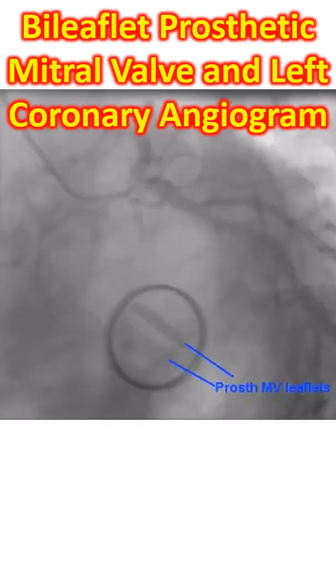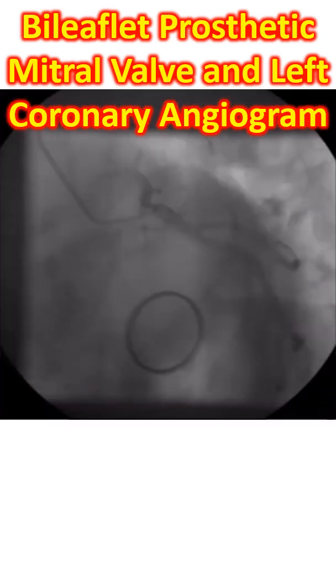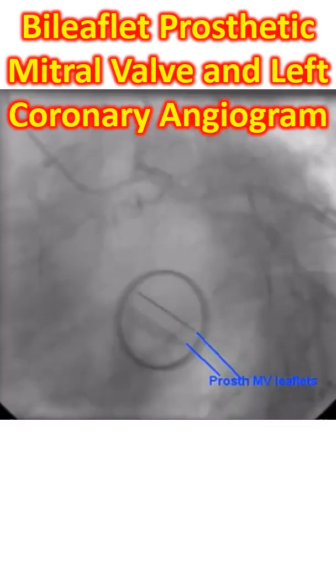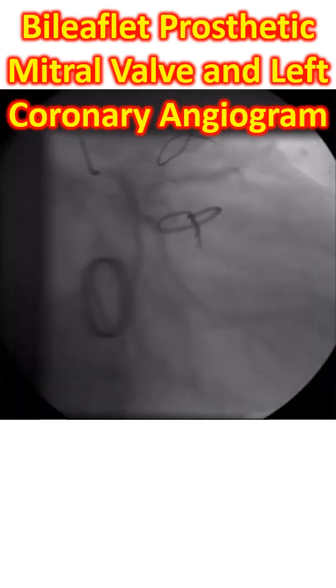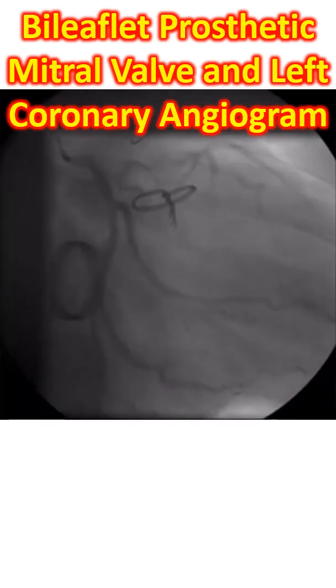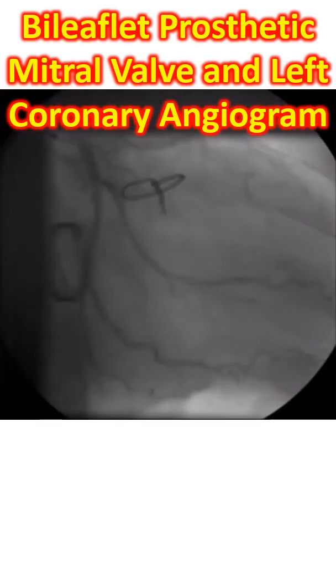The background shows a coronary angiogram. A Tiger catheter is seen in the left coronary ostium. This is another view — the RAO caudal view. The earlier one was the LAO caudal view.